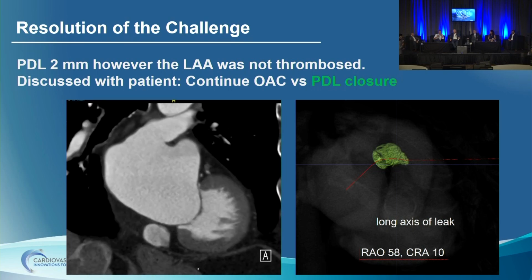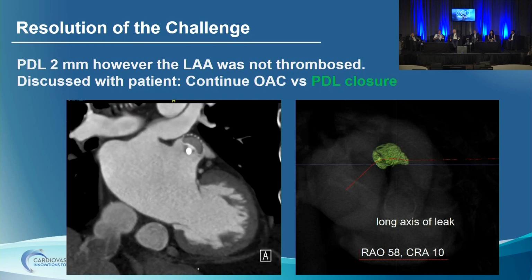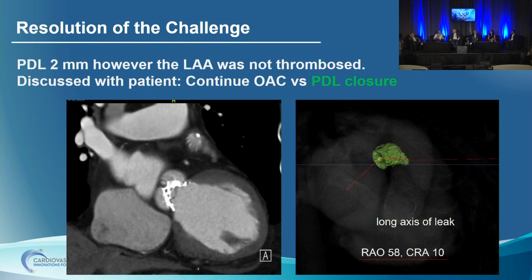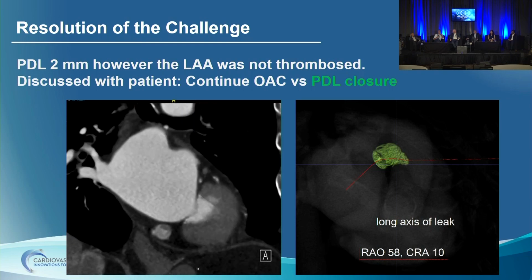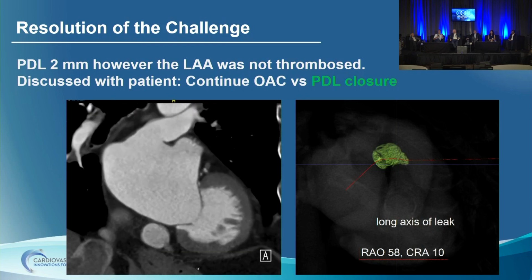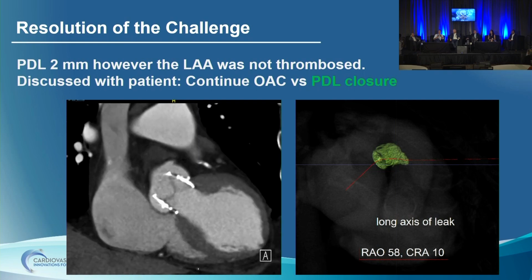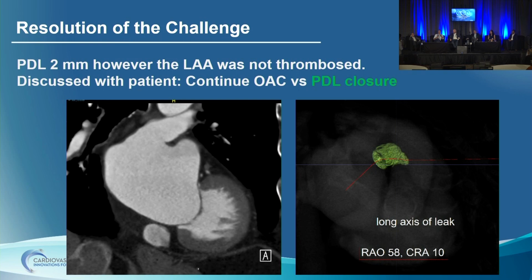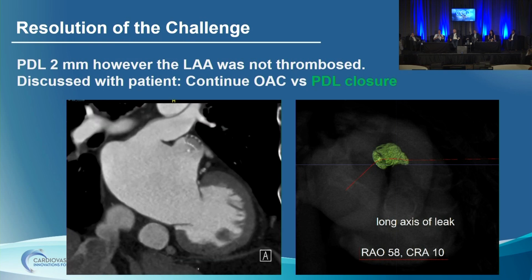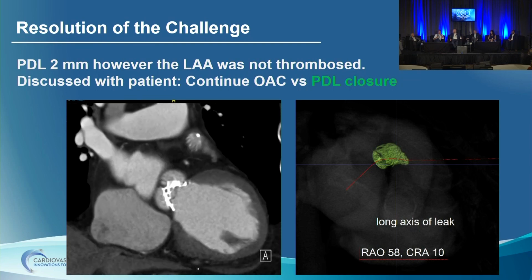Yeah, a couple of comments. First, the pectinates, that was an issue, and that's shockingly common. The CT looks like you have a lot of depth, and then on the 135 you see these massive pectinates, and it ends up kicking your device out. So you then intentionally decrease the size of your device. What were the compressions, do you know, on the 27 when you put it in? I think it was between 15 and 20. I don't have those exact numbers. It met IFUs for us to release. It looked like it was well compressed.